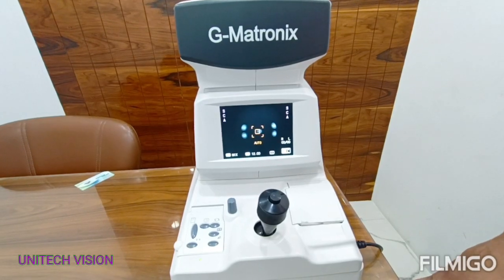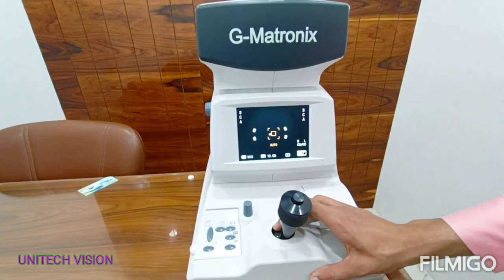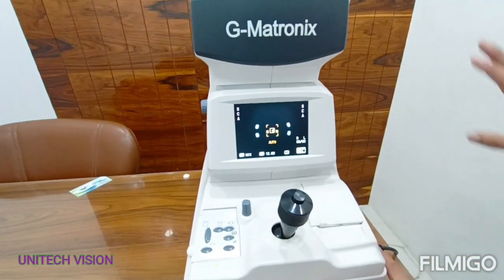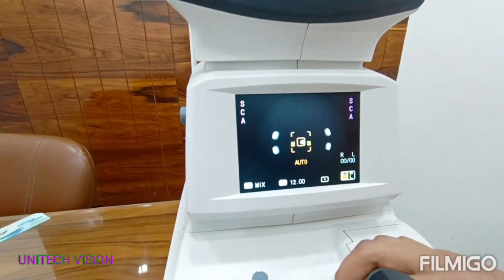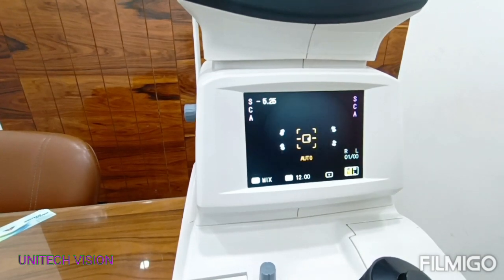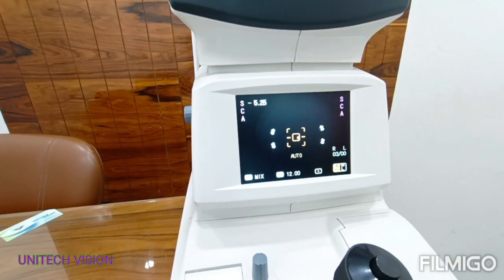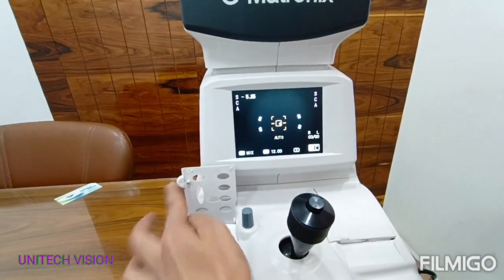Now I am taking a reading in automatic mode. Three dots mean the target is not clear. When the dot is single, then the target is clear. Automatic reading is complete.